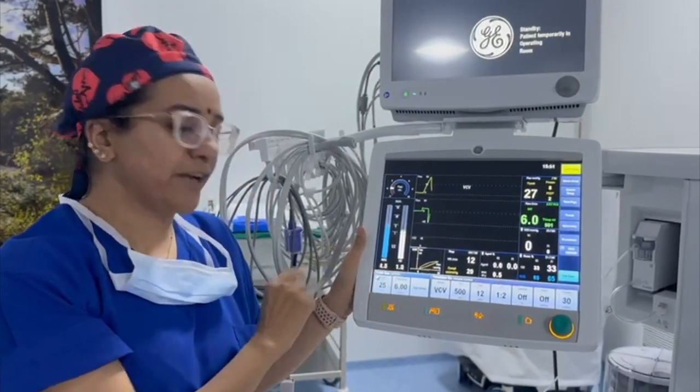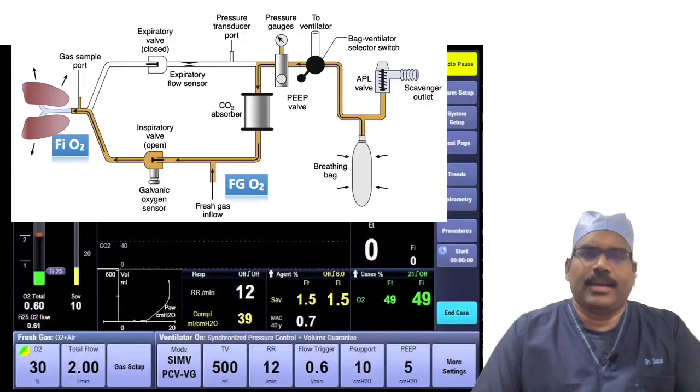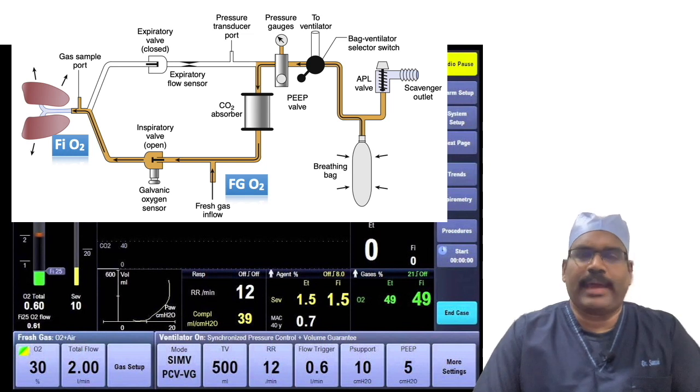The concept of FgO2 and FiO2 is very important to understand while using closed circuit, aiming at maximum utilization of the fresh gas. Over to Dr. Mukul Kapoor for the explanation.